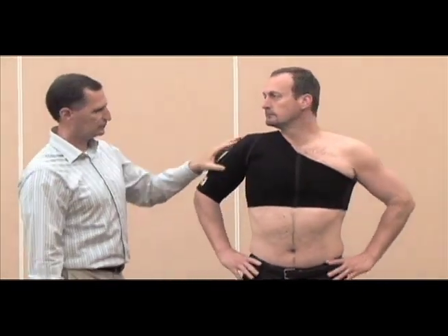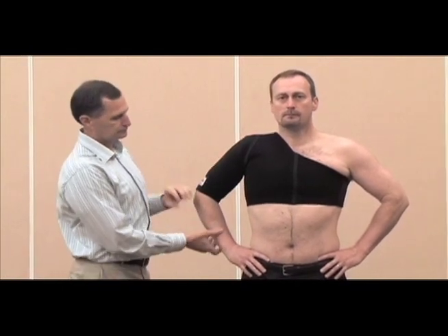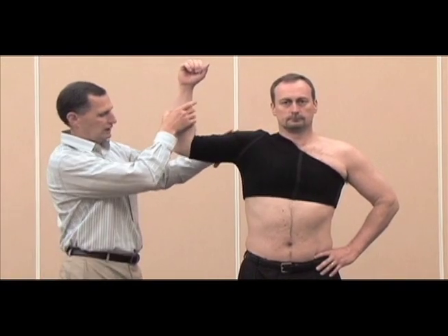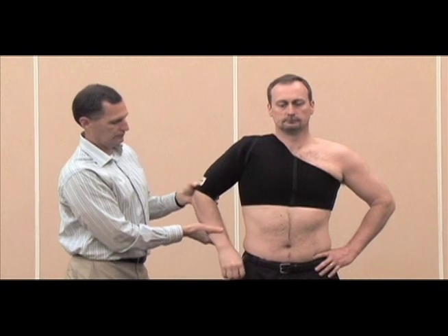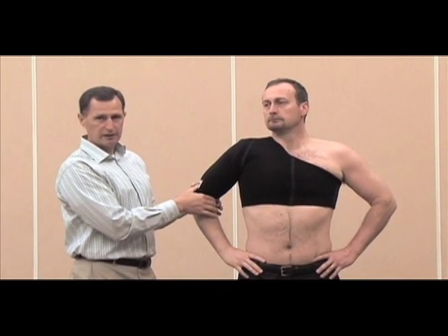What we've done is basically reconstruct the capsule of the shoulder. The Soli offers support all the way around the joint, just like the shoulder capsule would. We also have a little bit of tension created here by the Soli, securing the little bicep and pulling the humerus back up towards the glenoid.